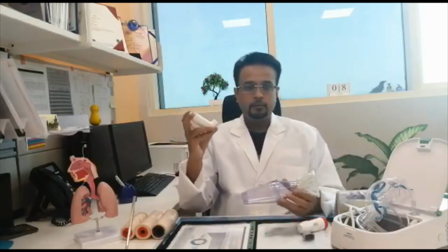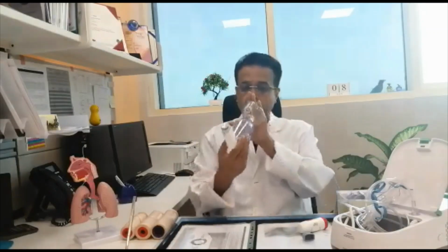So when you are using any inhalers, either the preventive or the relieving, shake them well and load it here and give one puff. This is the loading dose. And then when you are using the inhaler next time with the face mask, you give one puff and this mask will go on the face.